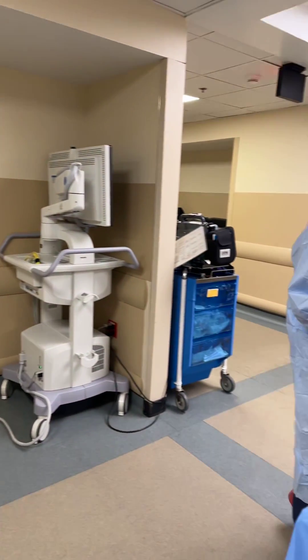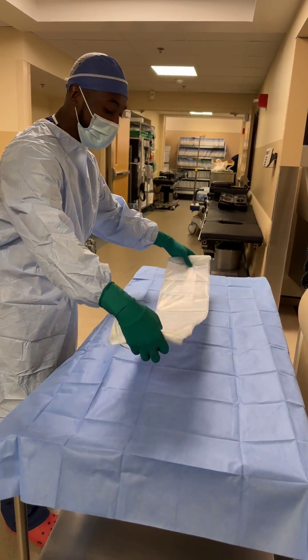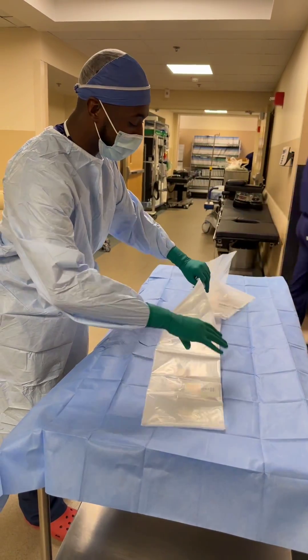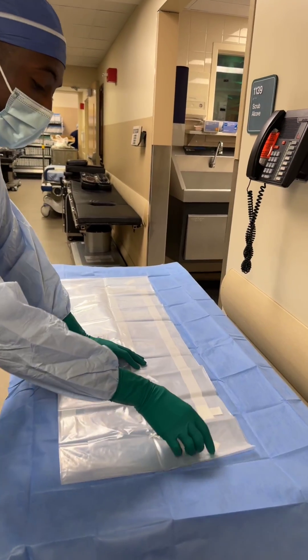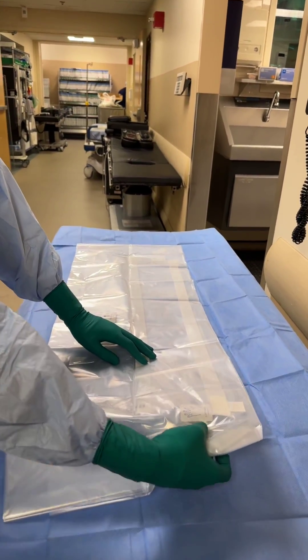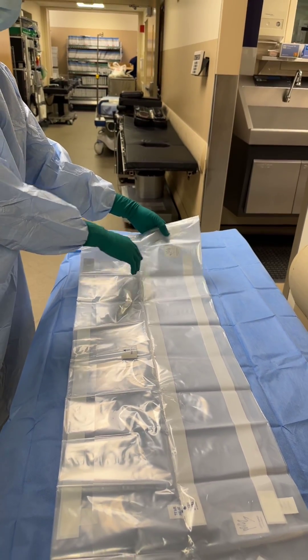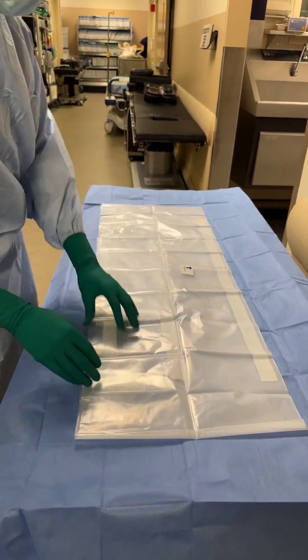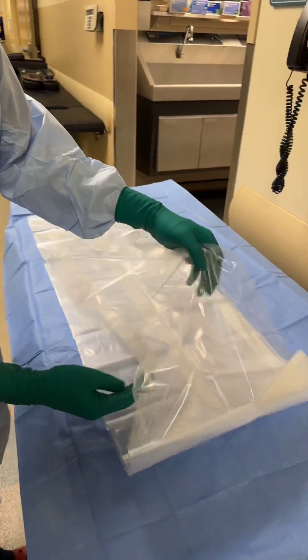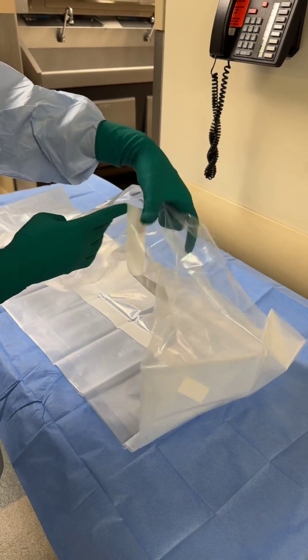At the table is where we usually open up the drape, just so that it can stay sterile. If you zoom in right here, you can see it says left hand here and it says right hand over here. And you want to make sure that when you open it, these strings are on the outside of the drape.